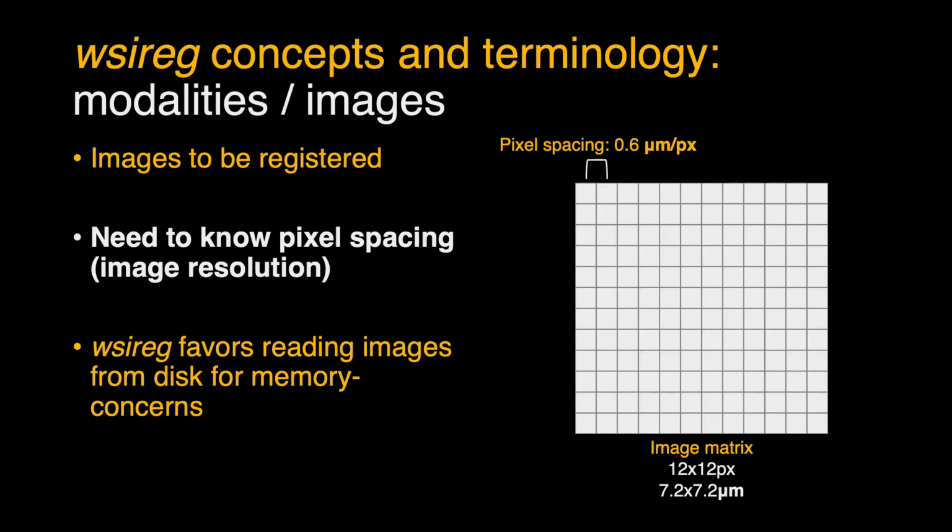Okay, switching from the what and the who that WSIReg is for, let's break into some of the concepts and terminology. First, starting with images or modalities. These two terms are used interchangeably in WSIReg. So these are the images that will be registered. You need to know the pixel resolution of these images. This is very critical. So this is the spacing between pixels.